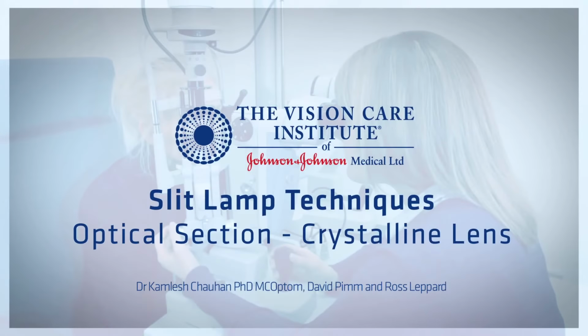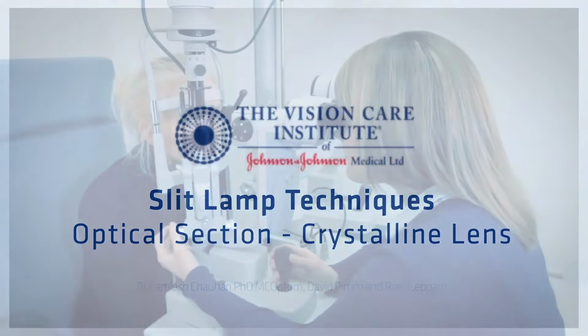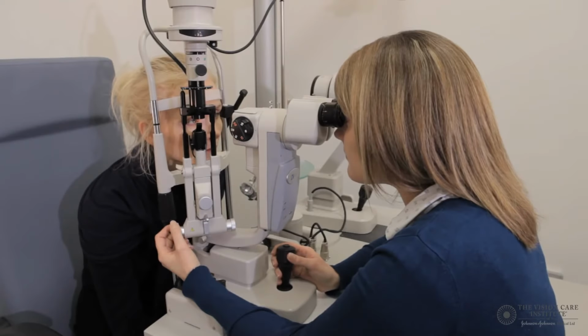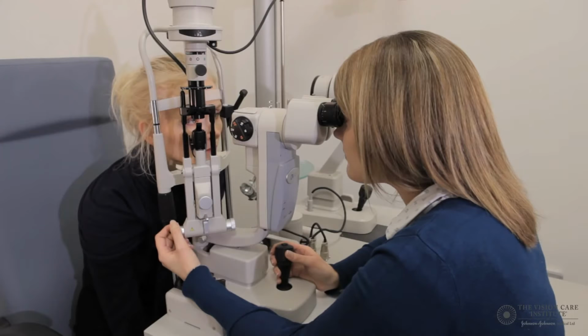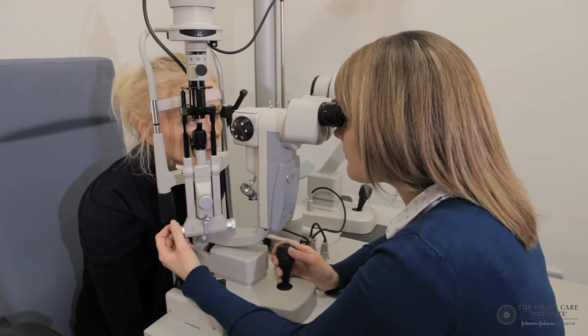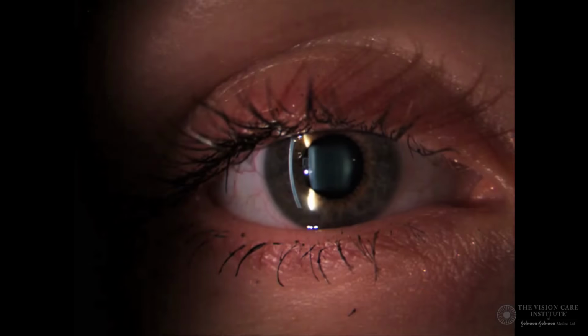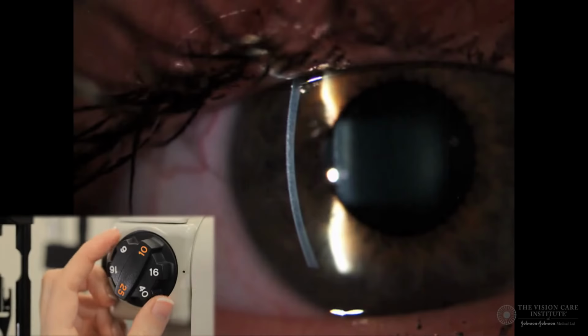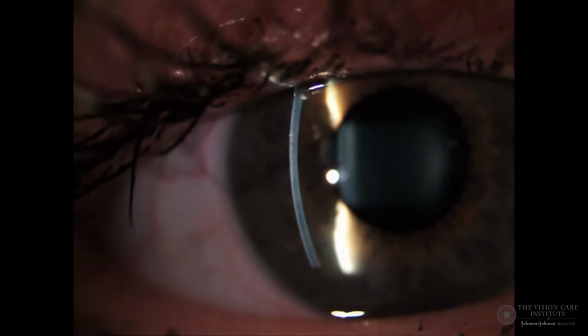Forming an optical section of the crystalline lens is an important part of the eye care professional's role, and by doing this, they can determine if the lens is clear and hasn't been affected by, for example, cataract. In order to form a lens section, we need to start with a thin slit and form a clear section of the cornea, as we have here.